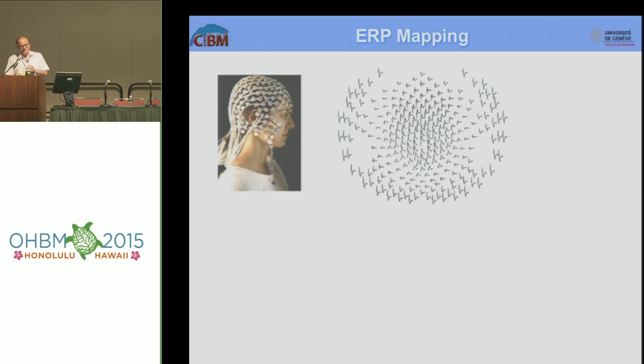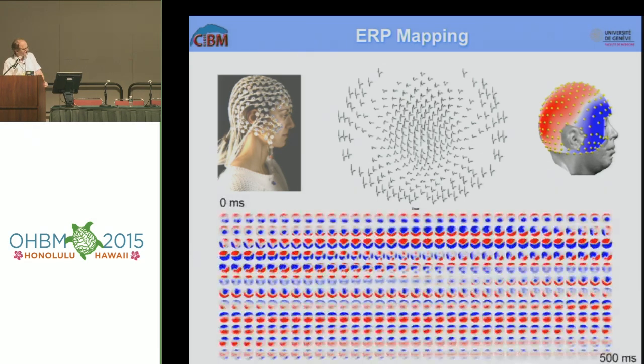So the way of analysis that I want to explain to you today is going directly to the electric field that has been produced by the momentary activity in the brain, and using these electric fields as the basis of your analysis. That's the starting point, as Thomas said. And from here, we go on and try to look for differences between conditions or differences between different subject populations.